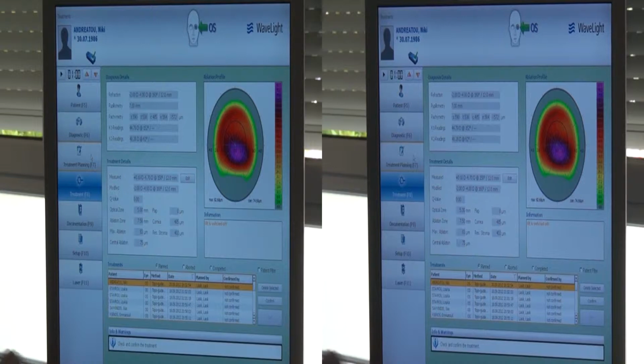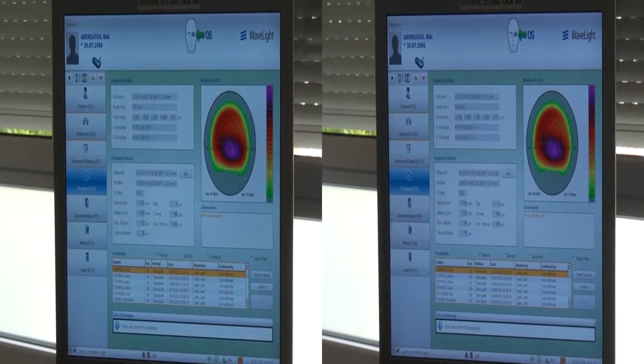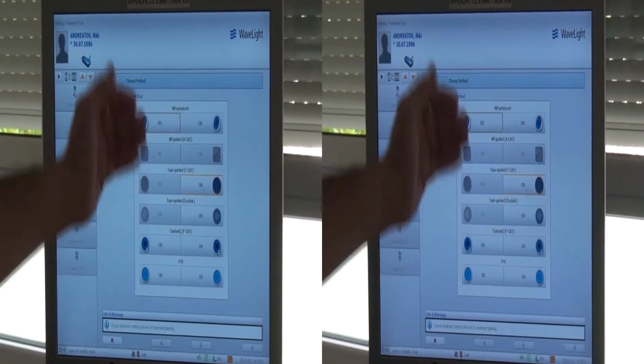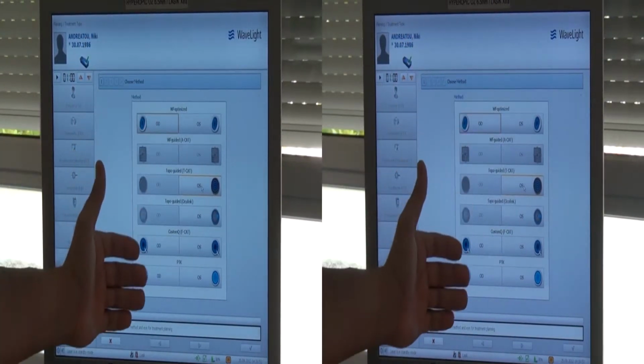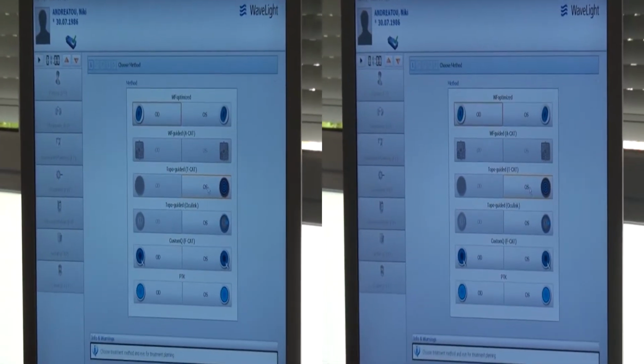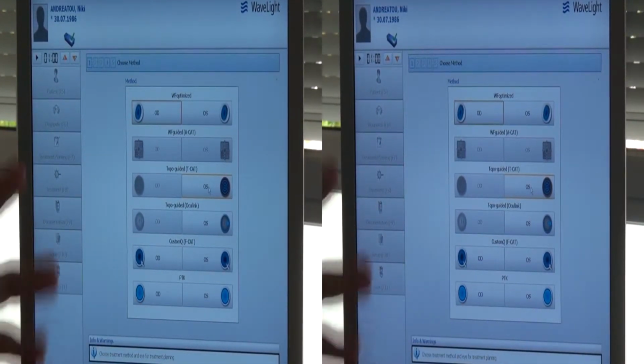This patient has a refraction of -3, -6.5, 6.5 diopters of astigmatism at 160 degrees. And with the help of my technician, Andreas, we're going to go to our diagnostic. Now here we can look into all the design treatments, and we can design all these treatments on our laptop down where we see patients. We don't come into the surgical room to design treatments.